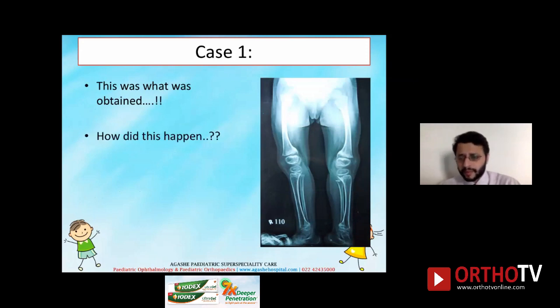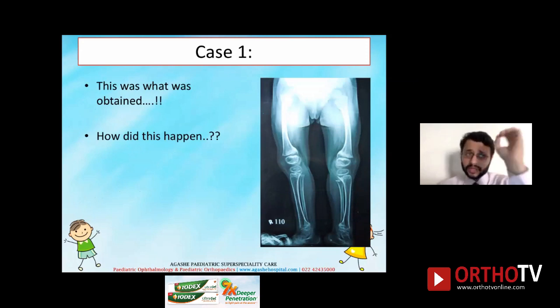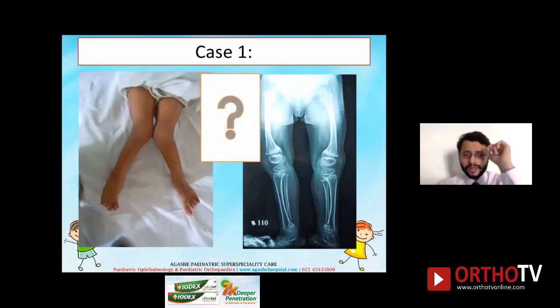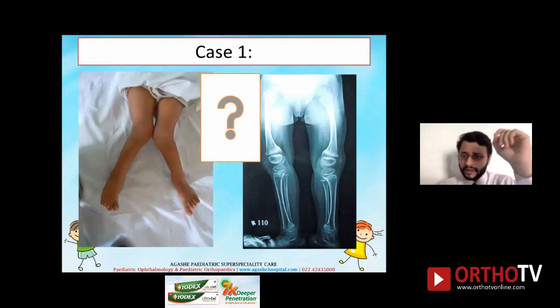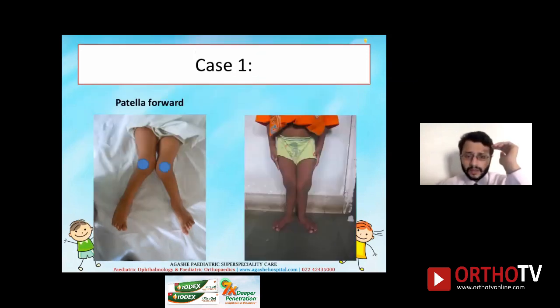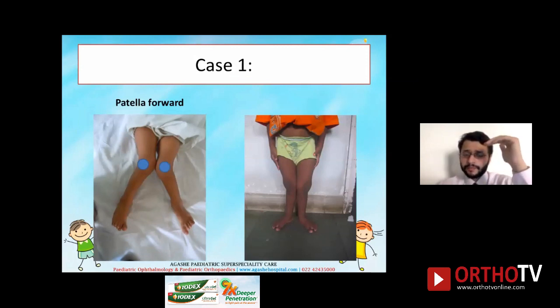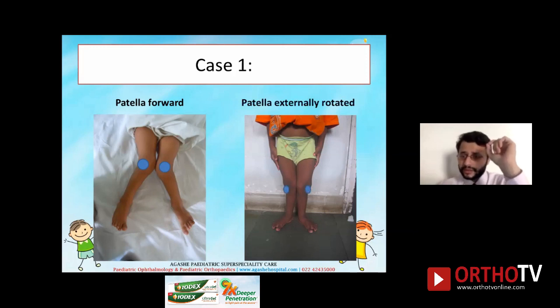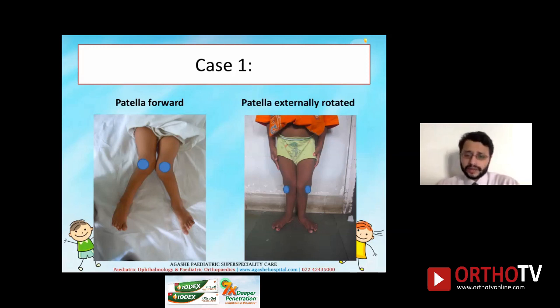This is a typical thing which happens with almost every scanogram, especially for genu valgum cases. When there is such a severe deformity, the X-ray technician tries to get a patella-facing-forward X-ray but is unable to fit the entire lower limbs in one plate. What he does is externally rotate the limbs so that both lower limbs fit into one X-ray plate.